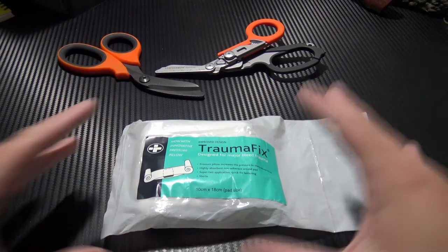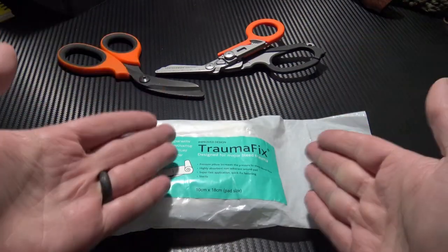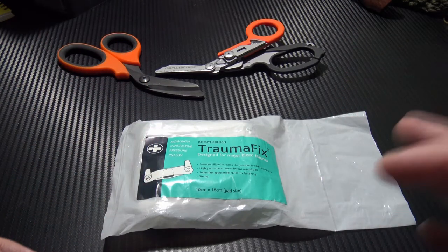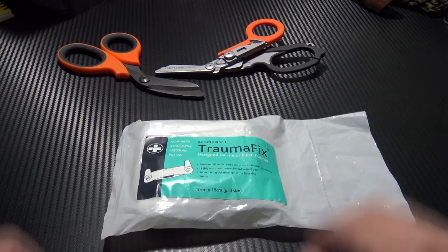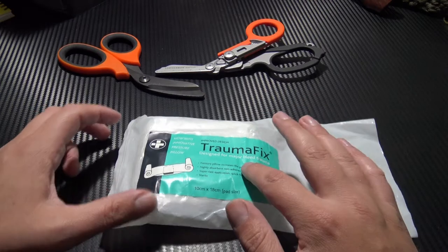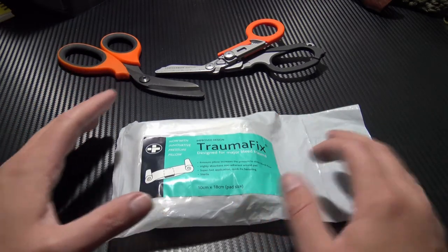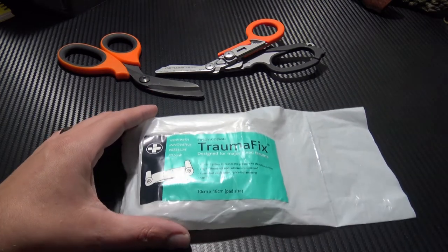This is bleeding that can be controlled with direct pressure. This is going to allow you to apply good, firm direct pressure while you do other things with your hands — you can't always hold it yourself. This is an improved design on the original Trauma Fix trauma dressing.